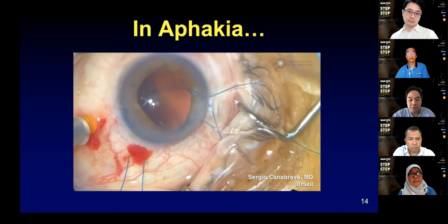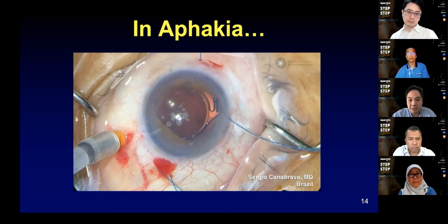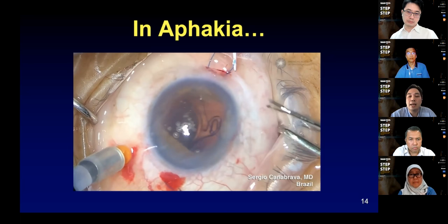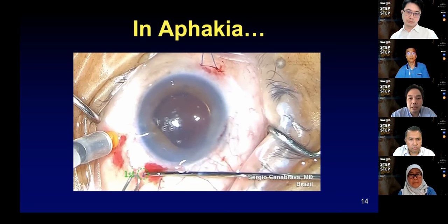Londiza already mentioned how when you're handling sutures, there's a potential to get things all tangled up. And after spending 15 minutes to put those things in, you get into the eye, it's all wrong, you have to take it all out and do it again. So he's actually showing here how this last part he's putting through into the 27 gauge needle and bringing it out transconjunctivally.